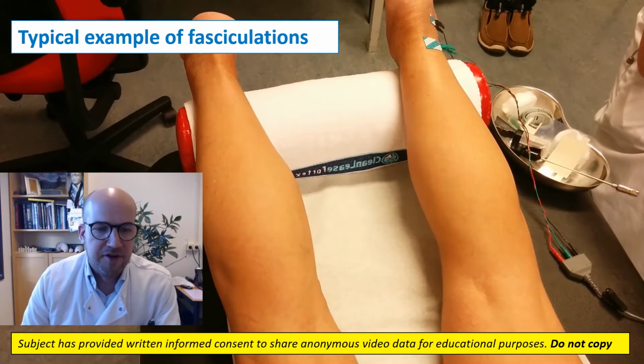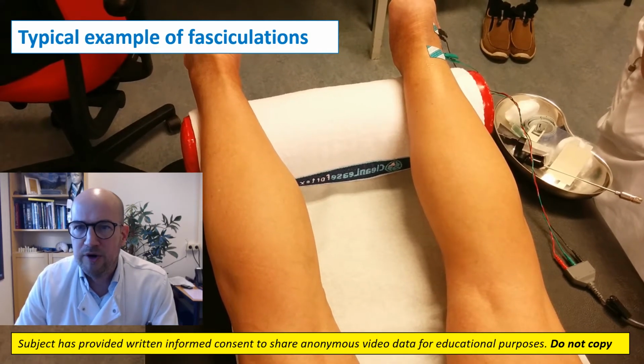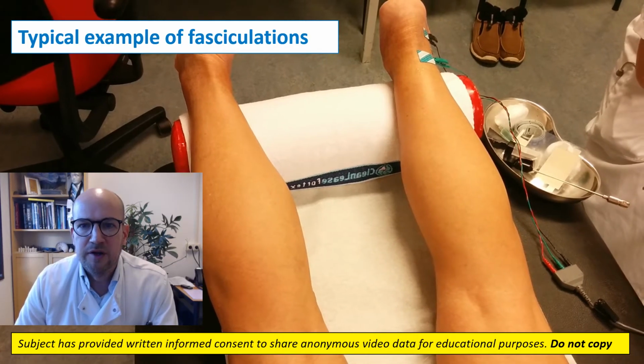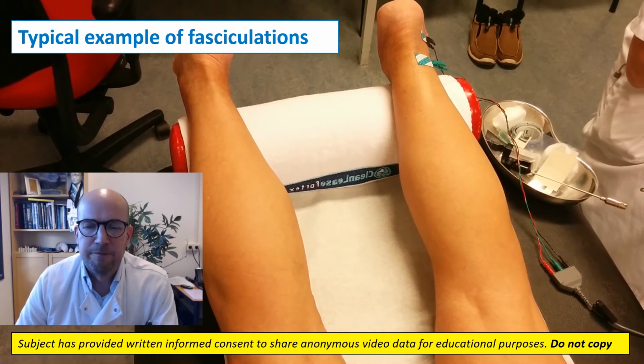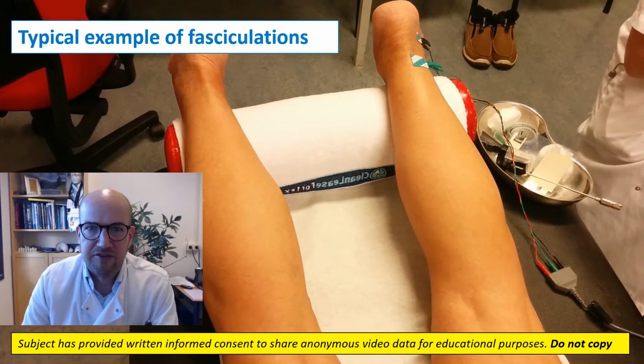This is a typical example of fasciculations in the calf muscles. Notice how brief and isolated these contractions occur. Whenever you think you see one, you turn your eyes, but it's already gone. A typical fasciculation potential lasts only several milliseconds.